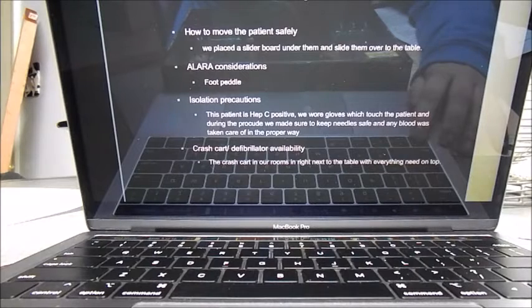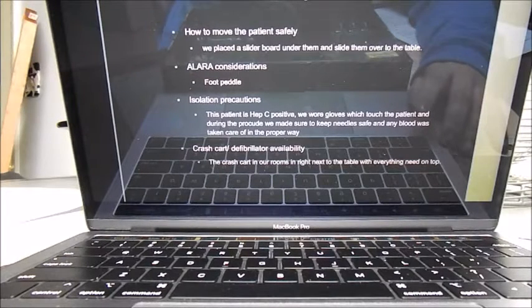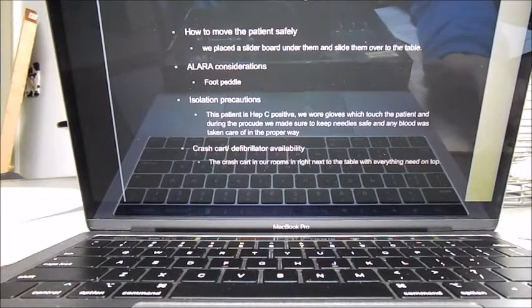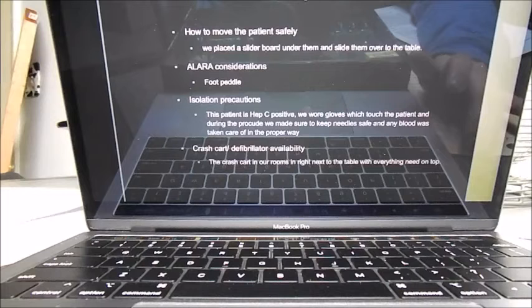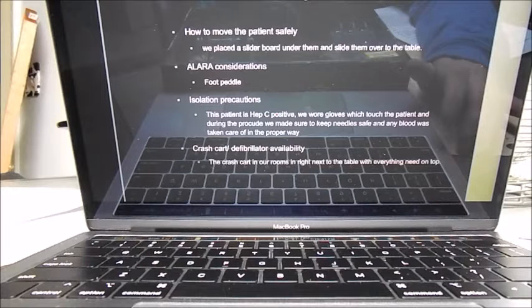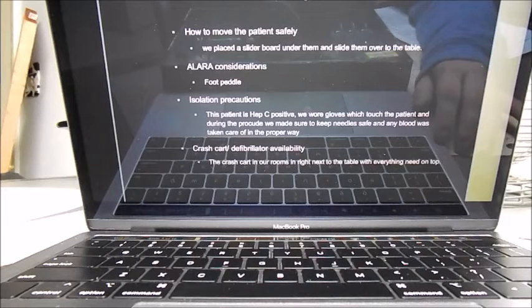For this patient they weren't moving very well, so we did bring the bed over to the table and put a slider board under them, kind of rolled them up and helped them scoot over.